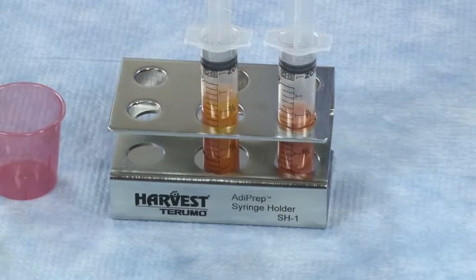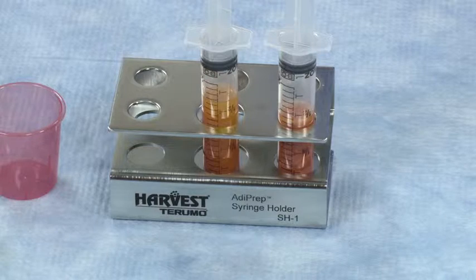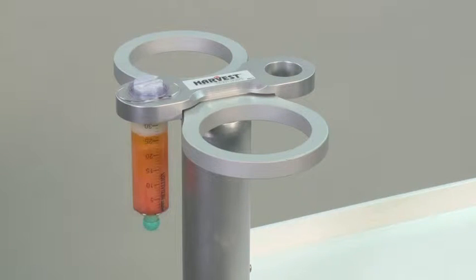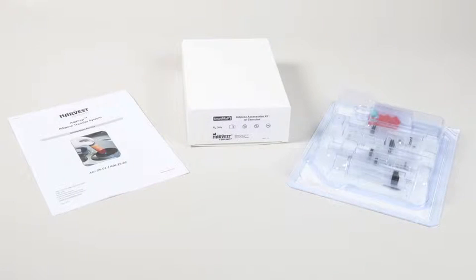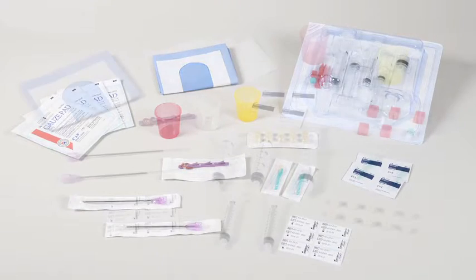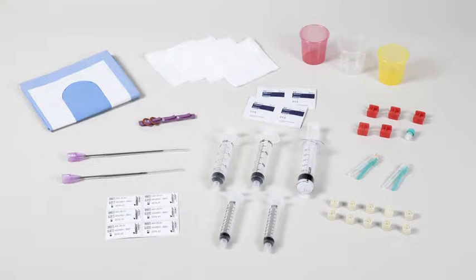The syringe stand is not packaged sterile and should be autoclaved prior to use. Also provided is a tube placeholder for the Adiprep process disposable, which may be attached directly to the SmartPrep workstation. And finally, an Adiprep procedure pack kit. The procedure pack kit contains all the materials needed to collect and process up to approximately 27 milliliters of lipoaspirate to generate concentrated adipose tissue.